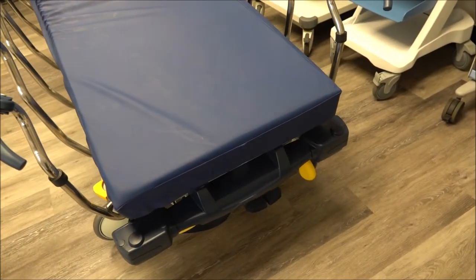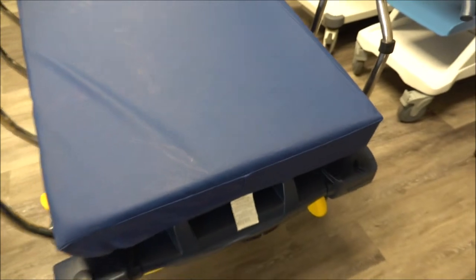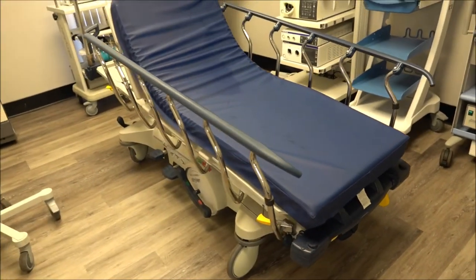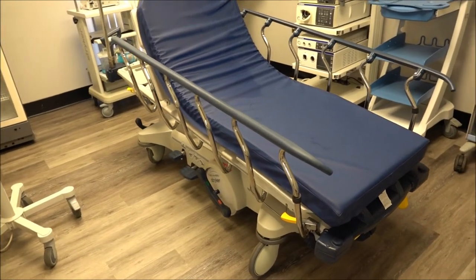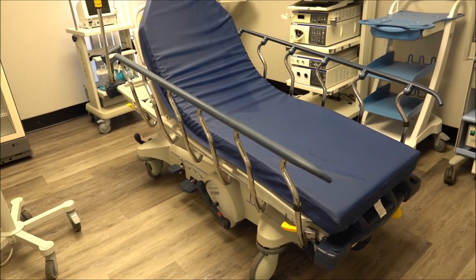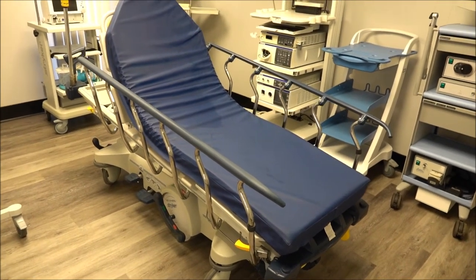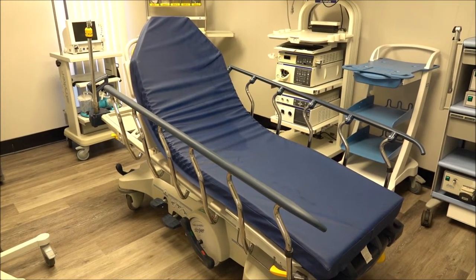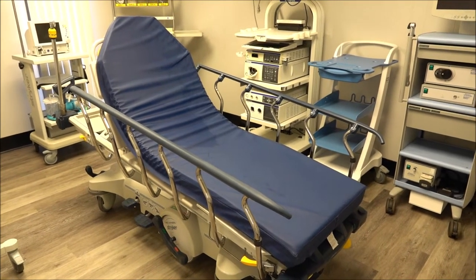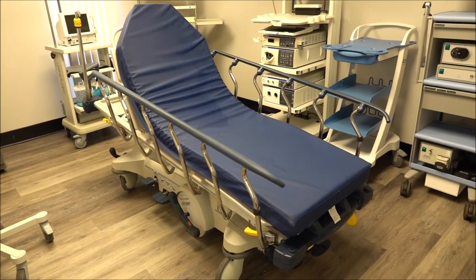They do have an optional knee gatch — some have them, some don't, depending on how they were configured. With this particular model, you would look for those features over here — that's your knee gatch. Stryker also made a Stryker 1005 and a 1007 — the exact same stretcher frame but without the big wheel feature. Also very durable and reliable. The Stryker 1005, 1007, and 1015 all have a 700-pound patient weight capacity, so they all have a bariatric weight capacity and are known as some of the most reliable and durable stretchers made here in the States.